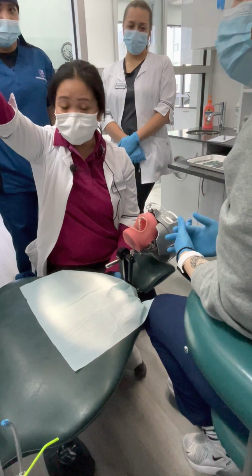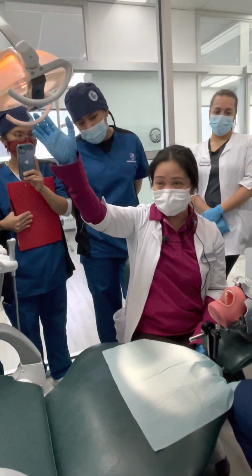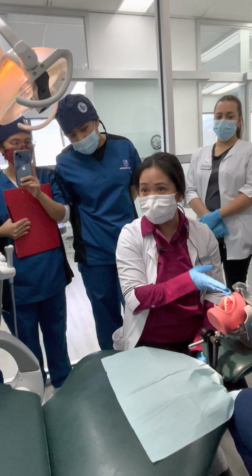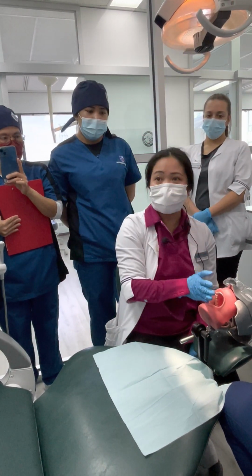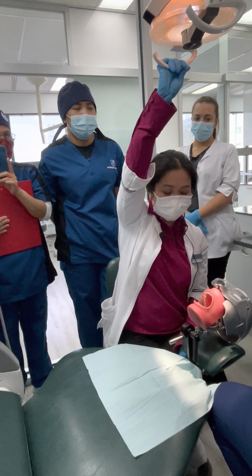Okay, so maxillary, it should be 25 degrees, right? Here, position it onto the maxillary. Now, if we're doing mandible, 90 degrees or overhead. So the light should be positioned here.